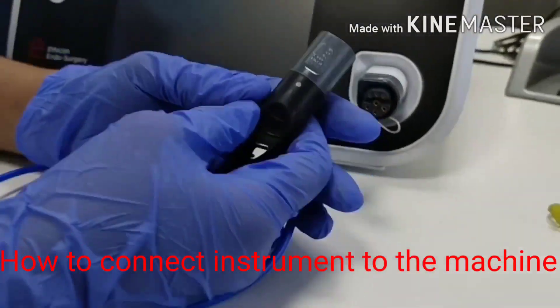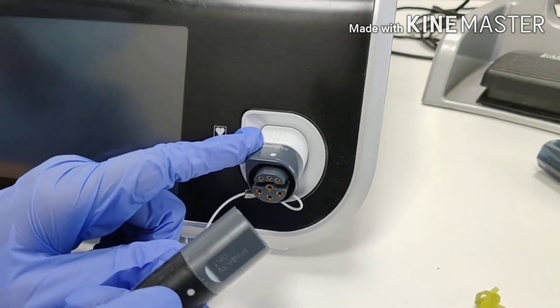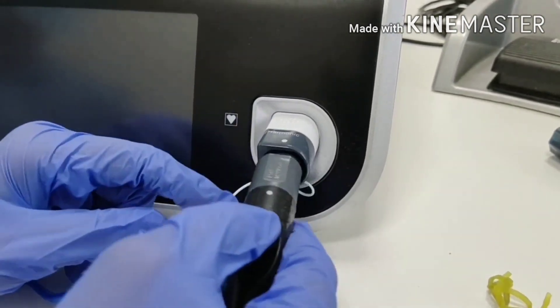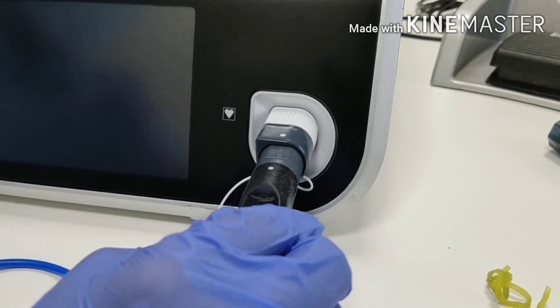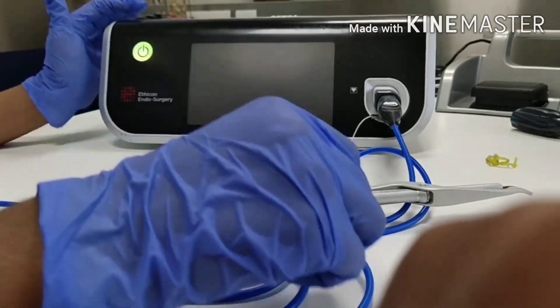Now remove this probe. To connect the instrument to the machine: here is one white dot, and the machine side connector also has one white dot. Match these two dots and insert the connector. A click sound will be heard. Now switch on the machine.